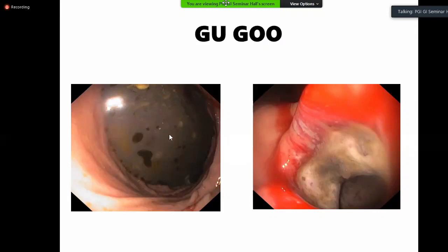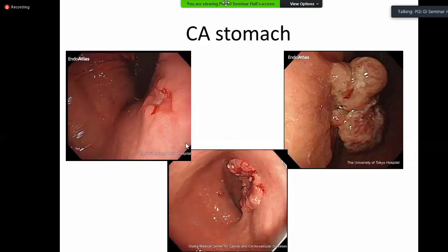Now, in a patient with GI bleed, this residue may obscure your view of the fundus. So what you do, you turn the patient from left lateral to supine or even right lateral. You turn the patient 180 degrees. This fluid will shift to the other side, and at best you elevate the head end or change the direction of the fluid. So that can give you a clear view of the fundus. This may be needed in many of the patients with GI bleeding.